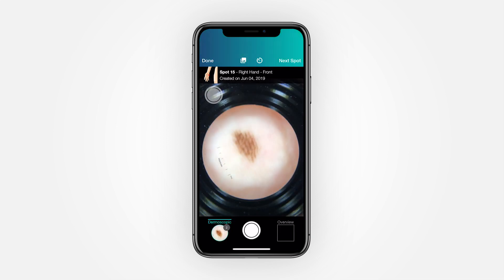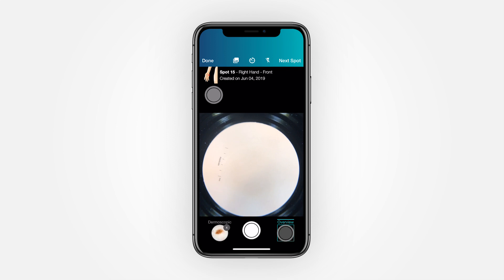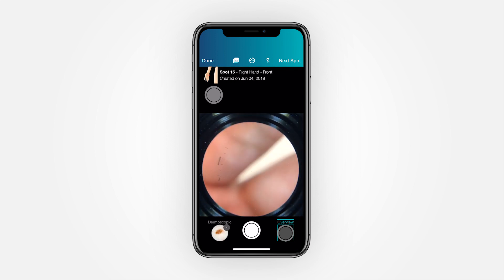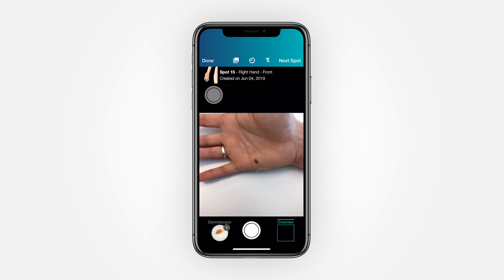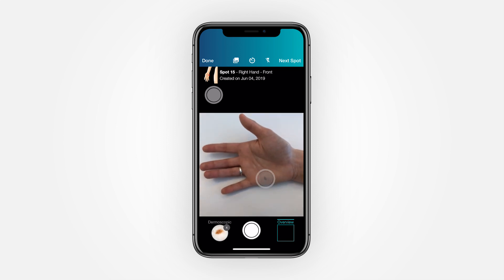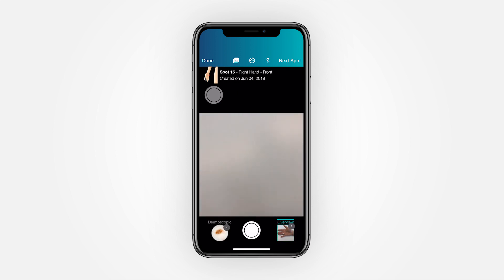Once complete, you have the option of deleting any images you do not wish to keep. To take an overview image, simply press Overview, remove your molescope, and take the image like before — remember to tap to focus on the spot. If you have additional spots to follow up with, select Next Spot and repeat the process. When finished, tap Done.